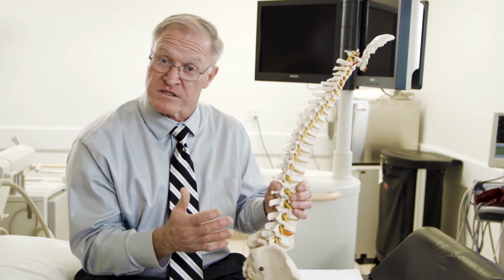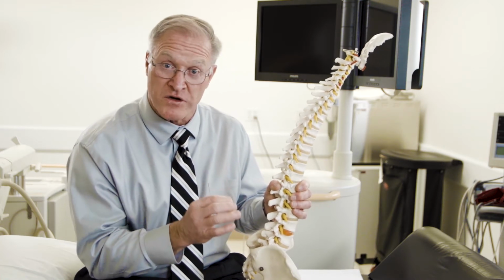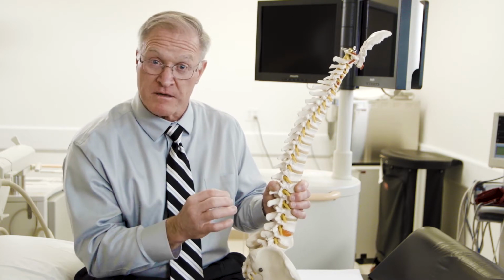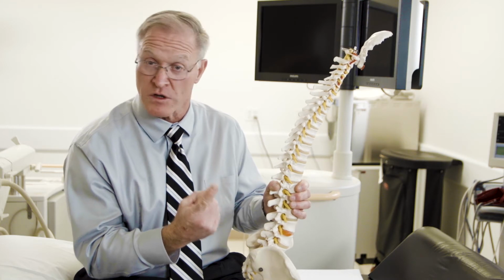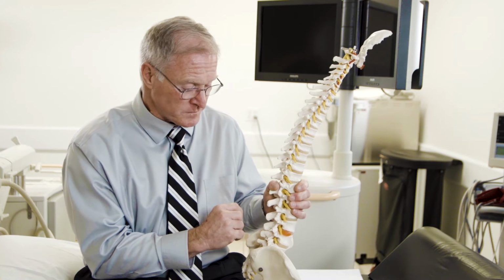And I like to tell patients that this is not an error, it's not an accident during the procedure, it's actually the targeted goal of that procedure to be so close to that root that we stimulate it, but then we can also put the treatment medication, diagnostic medication, which is the local anesthetic, and the treatment solution, which is the steroid, directly on that root.